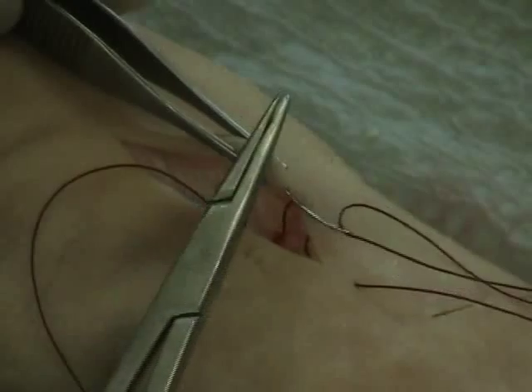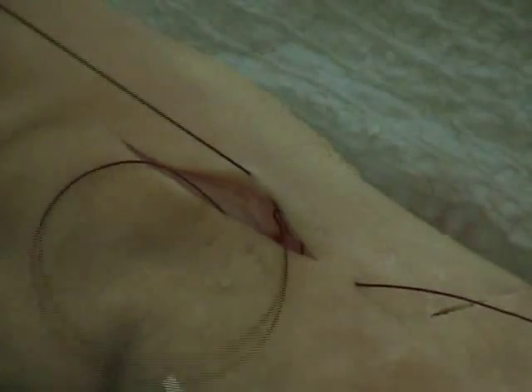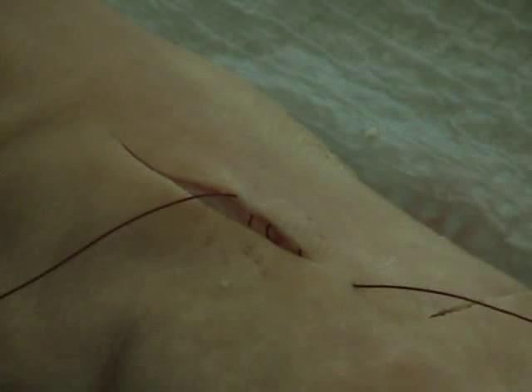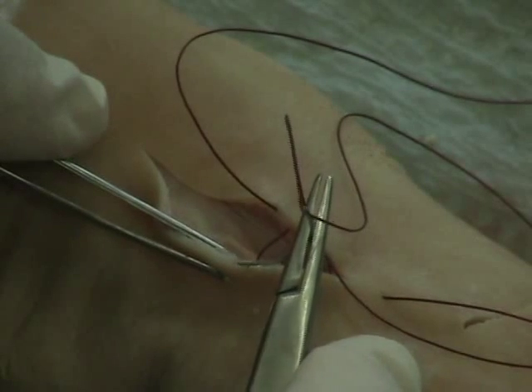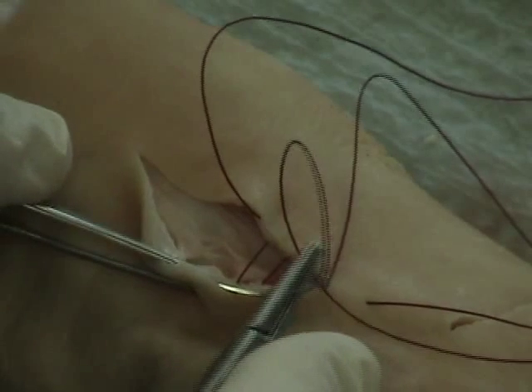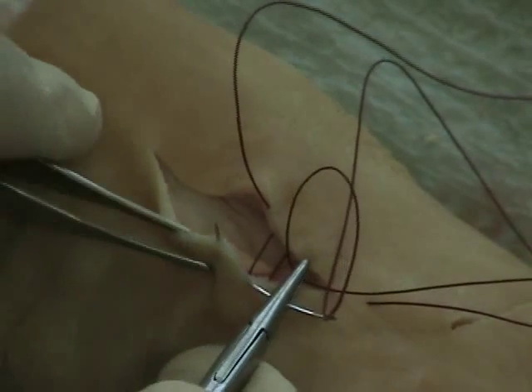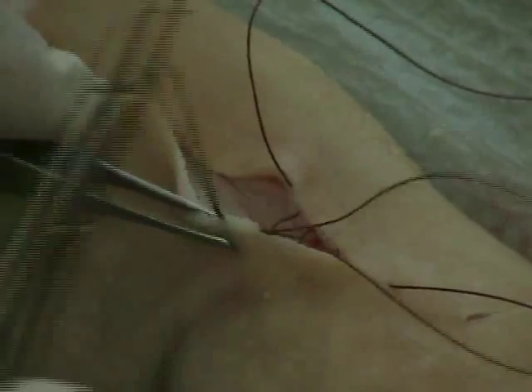You also want to maintain the same depth on both sides. If you're higher on one side than the other — like what we experienced with the three-point and four-point corner stitch — one side will end up higher than the other. If the needle does come out the top, just back it up and reposition so it comes out the side instead.